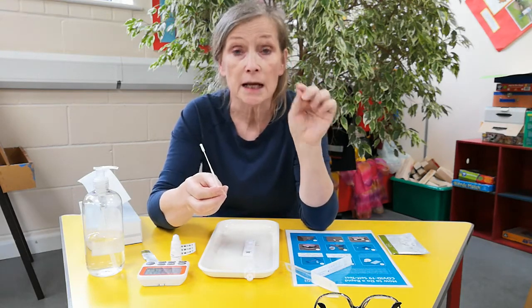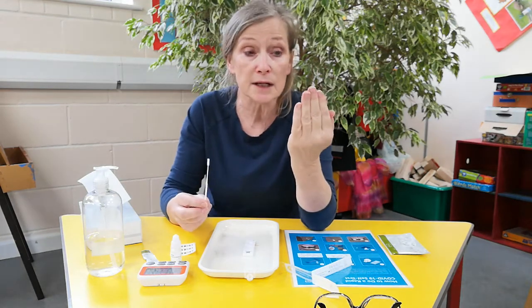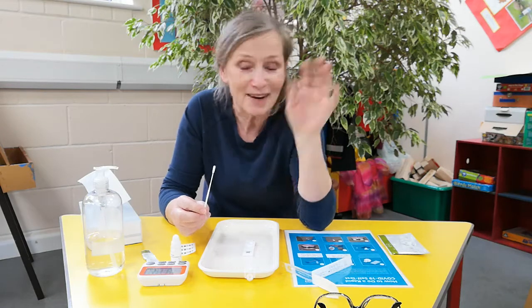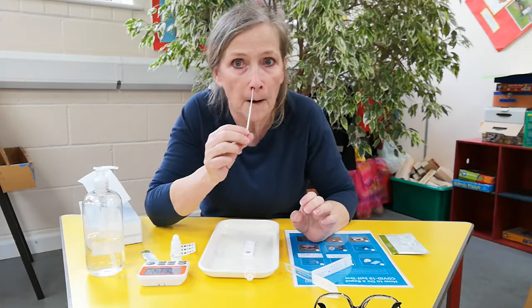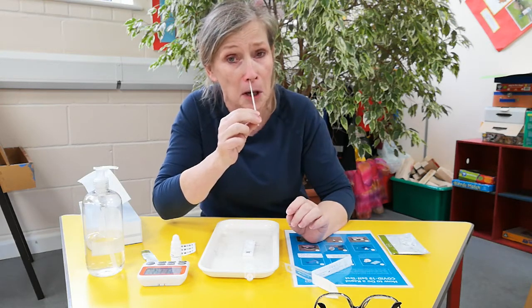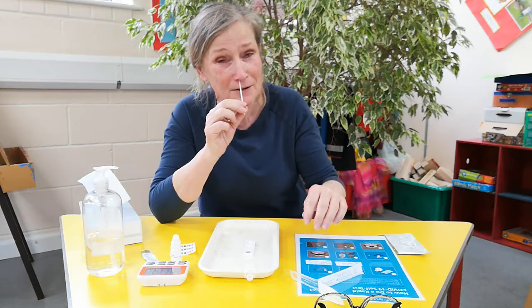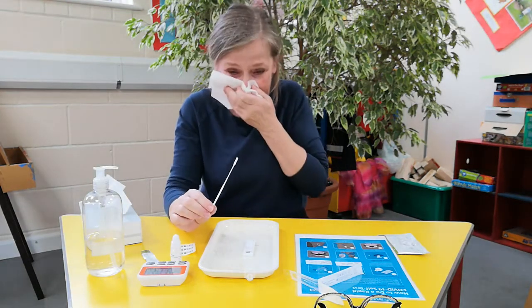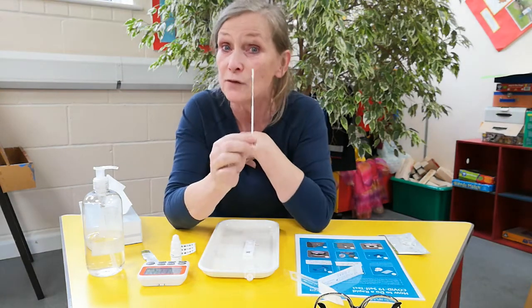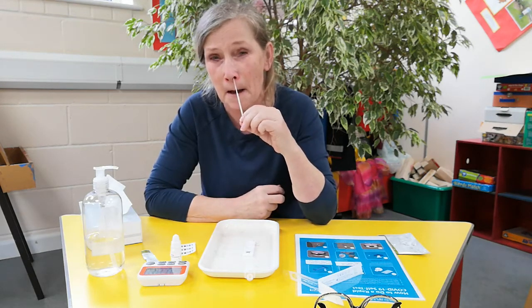This is the fun bit. If it makes you cry or sneeze, it means you've done a good job. What you've got to do is get it right up the nose — I'm not talking about this squidgy little bit here, I'm talking right the way up the nose. You might find it easier to use a mirror, or after a while you won't need one. So you're going to go up your nose — it doesn't matter which nostril you go first. Go up the nose and you're going to go a long way. Look how far I've gone up. It's not pleasant, I have to tell you — it's not awful, but it's not really nice either.